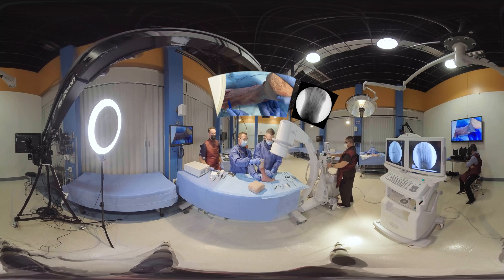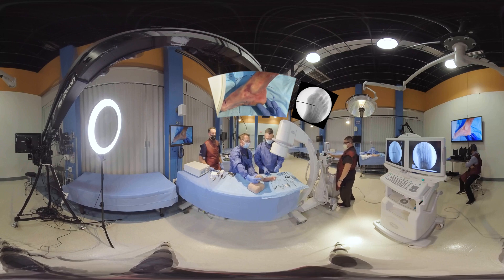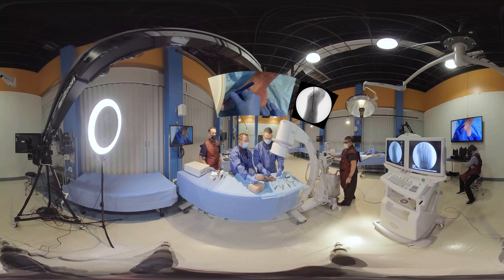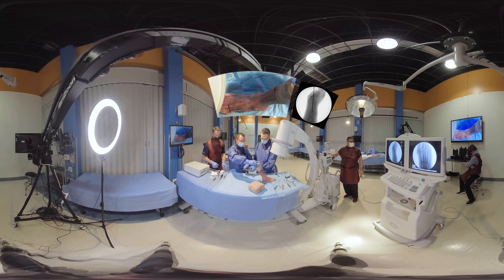So there's the level of the neck of the first metatarsal. We're going to do a line across here, right along my wire, so I know where the exact level of the neck of the first metatarsal is. And we're going to do on a lateral, also mark the lateral trans mid-diaphyseal line of the first metatarsal. So where these lines intersect is simply where you're going to put your wire to insert your wire for your placement of your osteotomy.